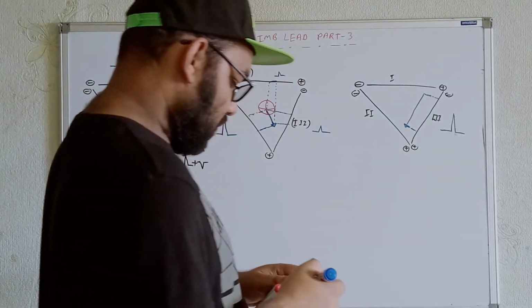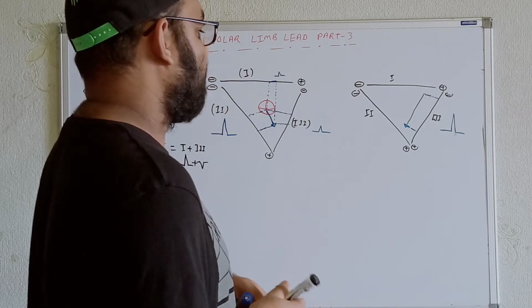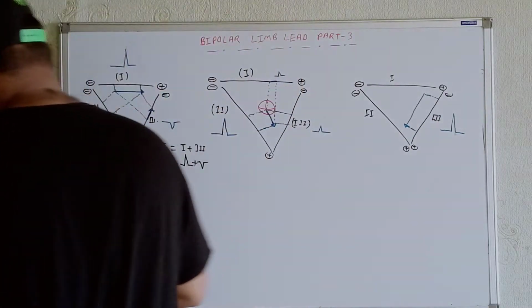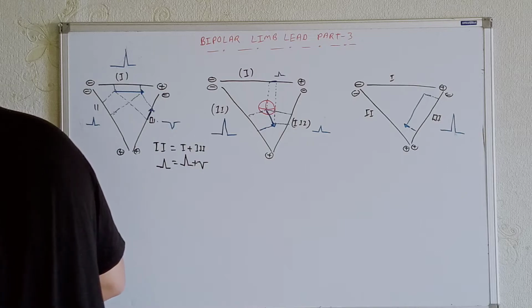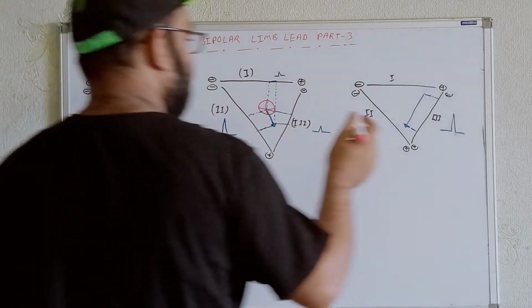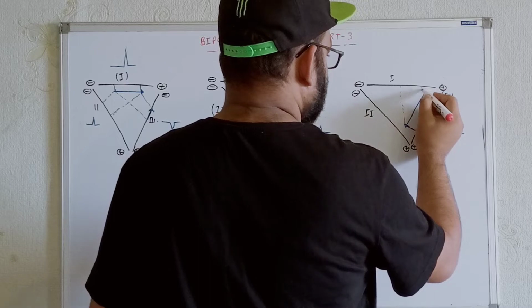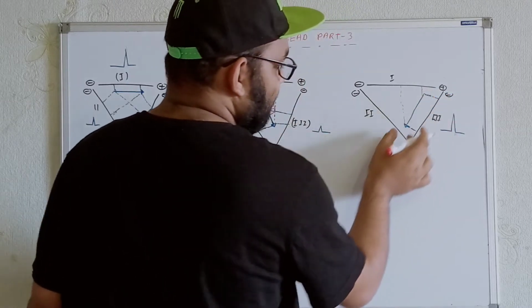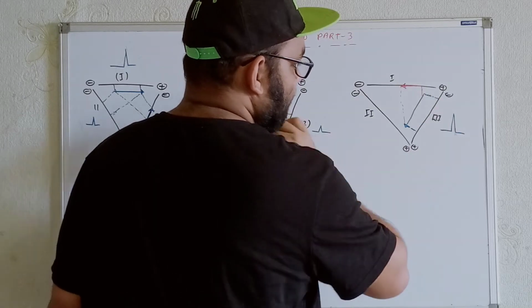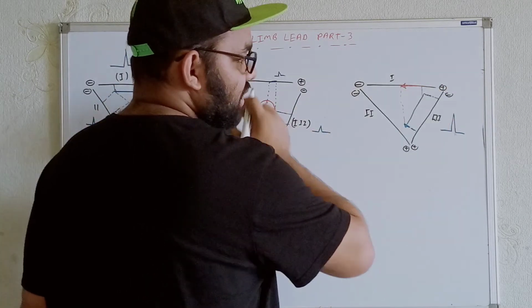Okay. Now think about lead number 1 and lead number 2, whatever we get over here. Now see, if we draw the line over here, let's draw with this color only. See, if we draw in these directions for lead number 1, we are getting in this direction. So definitely the direction for lead axis 1 will be in these directions. Try to understand, it is coming in this direction, so definitely it should go in these directions.